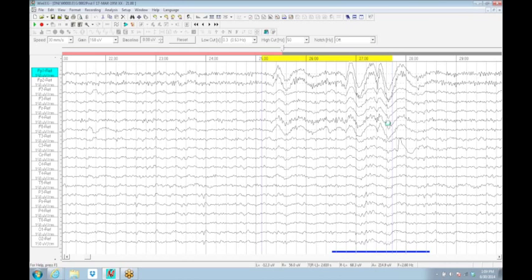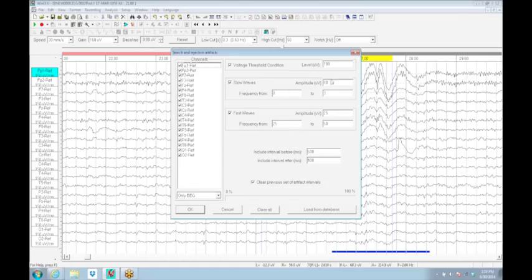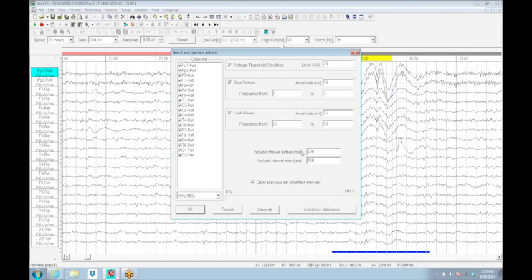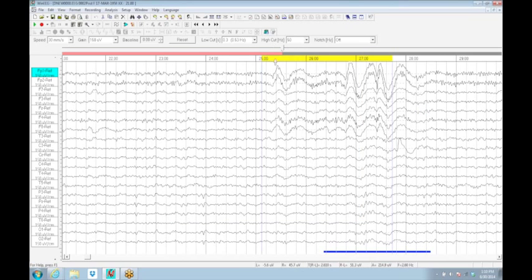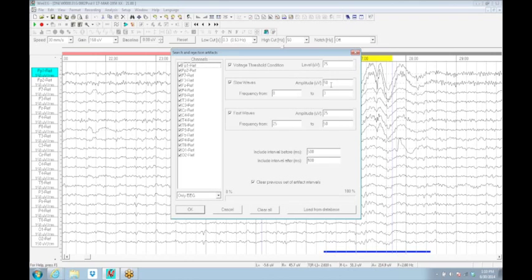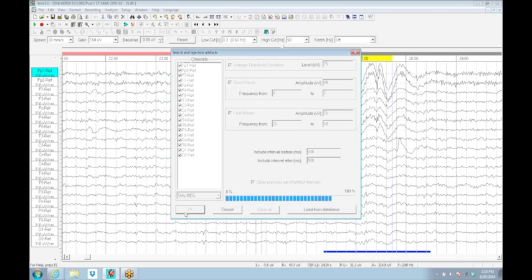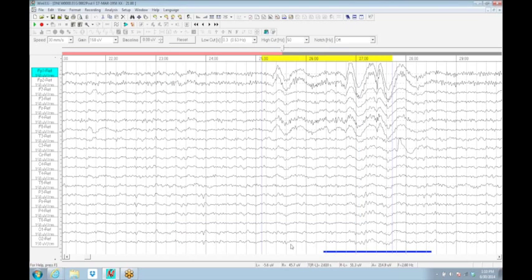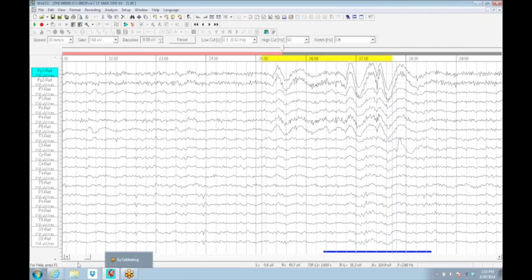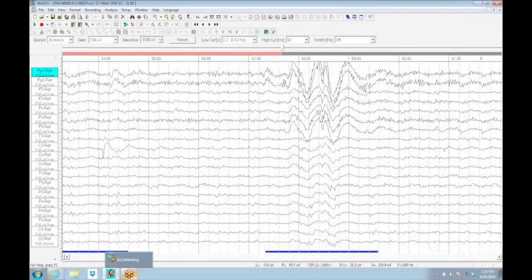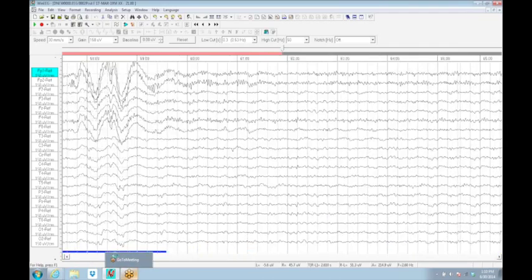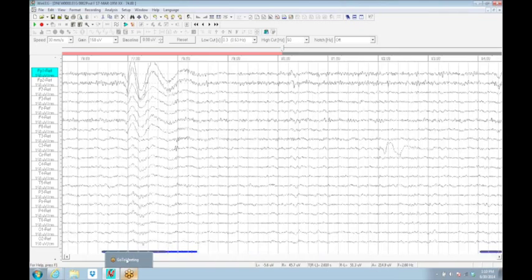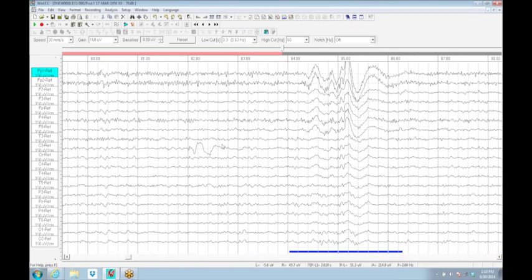Alternatively, if we tweak this very gently to catch maybe 50 microvolts and 75 microvolts, we'll probably catch more of this eye movement. We don't catch quite as much as I would like to catch. We'll have to adjust this down perhaps even further. Adjusting this slowly to catch all those little pieces, you can end up with an automated catch of all of the pieces that meet the definition.